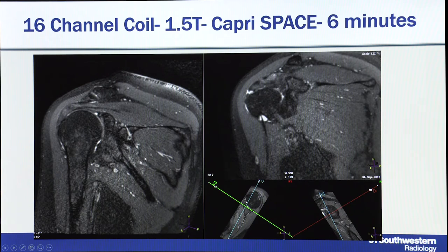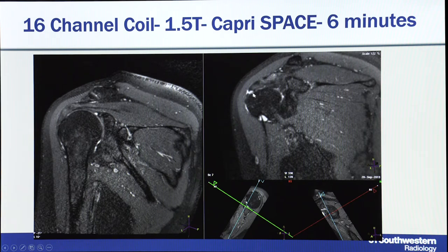The same approach is possible for the shoulder, and it's now possible at 1.5 tesla also. On one of our newer Siemens Solar scanners, the Caipirinha SPACE is acquired in about 6 minutes. You can reconstruct in any plane — here it's reconstructed along the axis of the scapula so you can see the supraspinatus coming down and not attaching at the greater tuberosity: a full thickness tear.